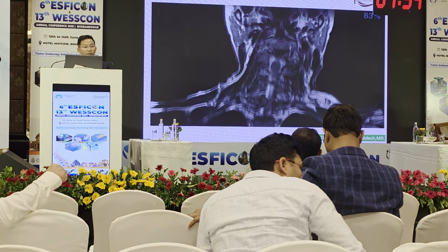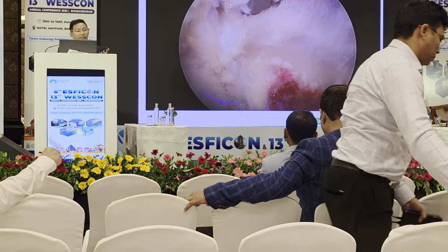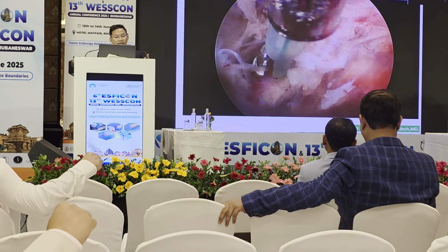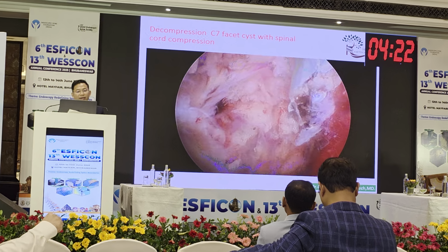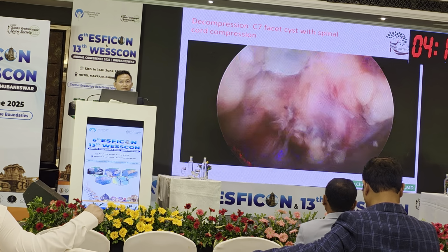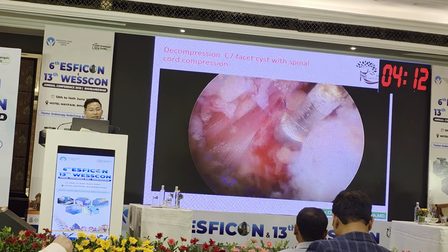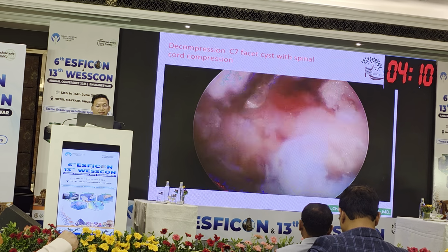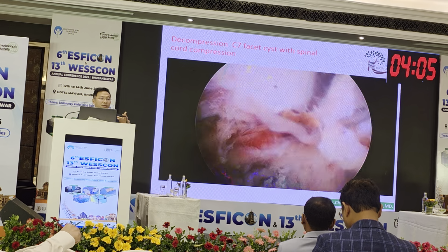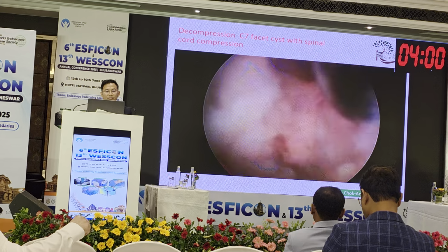This is my video of the surgery. I start like the first case, with bilateral decompression first. After that, try to identify the border of the cyst. After that, try to remove it gently. This is my quick video at around 2x. Maybe too quick.